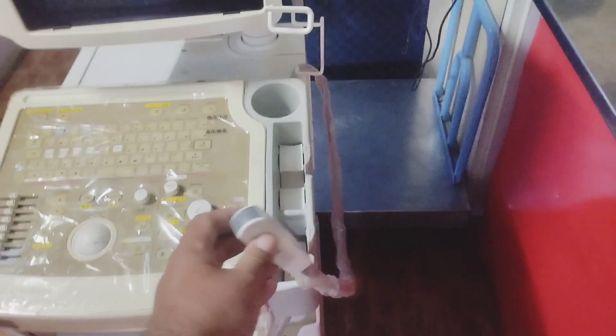We have two probes with this machine. We have a Micro Convex probe, and we have one more probe — two probes in total.